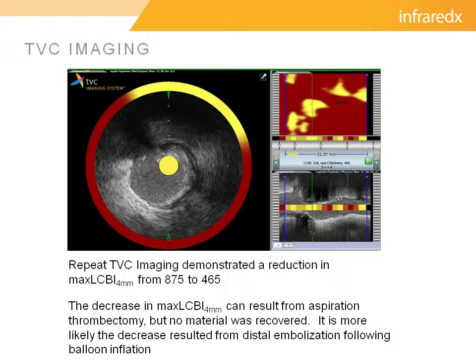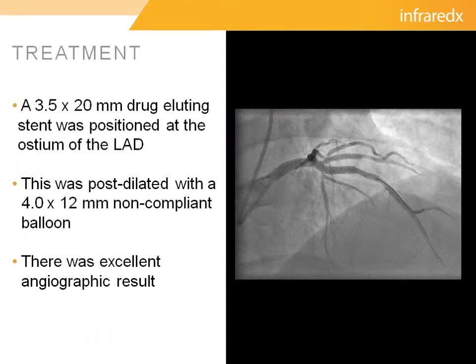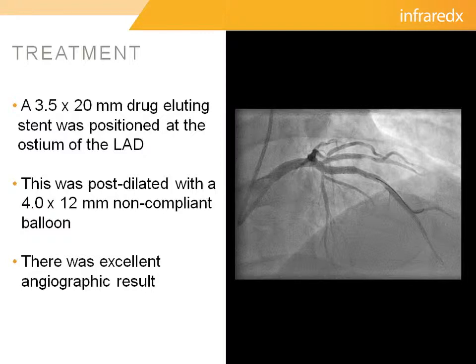These transient ST elevations were treated with intracoronary nitroglycerin and resolved fairly promptly, and there was no significant cessation of flow into the LAD. We proceeded to stent with a 3.5 by 20 millimeter drug-eluting stent. And as indicated previously, and as you can see angiographically, we positioned the stent at the true ostium of the LAD, slightly further back than we would have originally. We felt that there was an excellent angiographic result after we post-dilated with a 4.0 balloon, and we were very happy with this result.